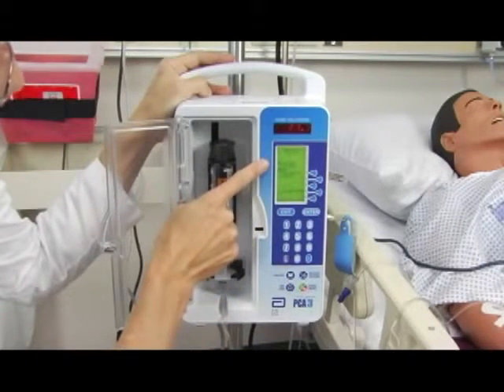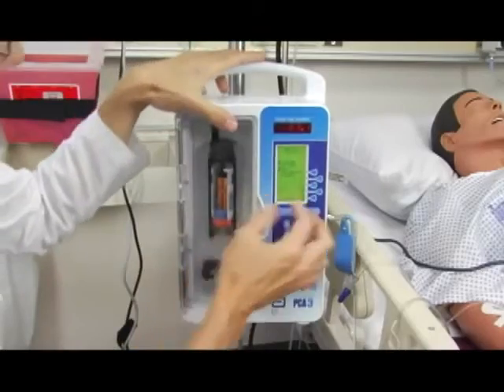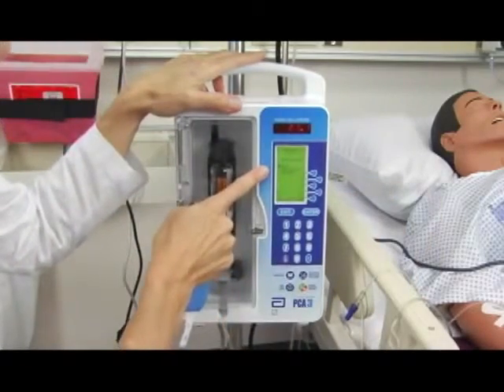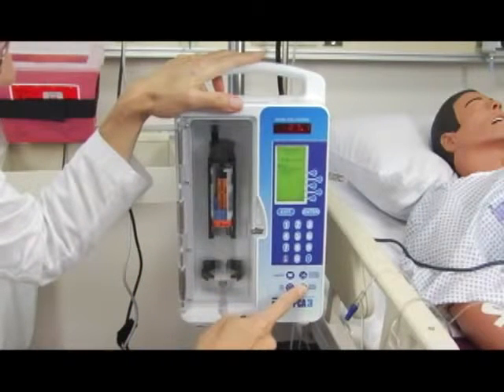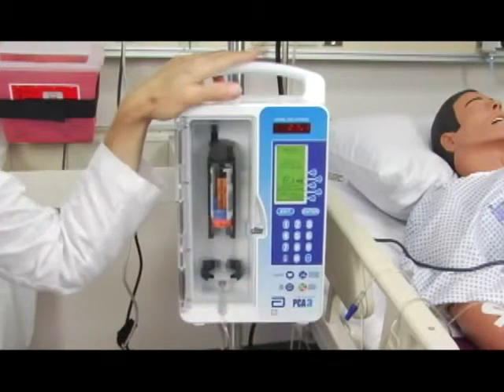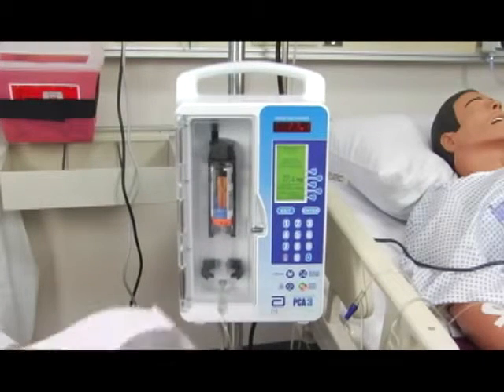The instructions now tell you to close and lock the door, and then press the start button to begin. And it reminds you to press that start button again. So we'll come down to the bottom where the start pause button is and press that. And so now we've made the changes that we wanted to make based on the physician's orders.